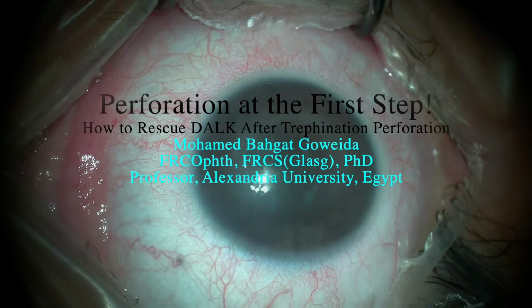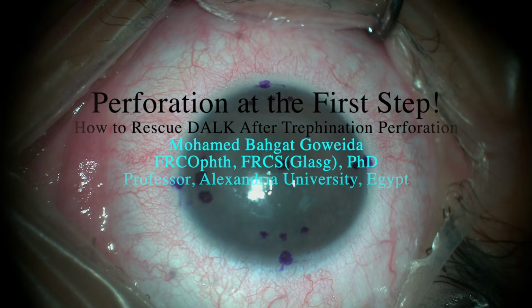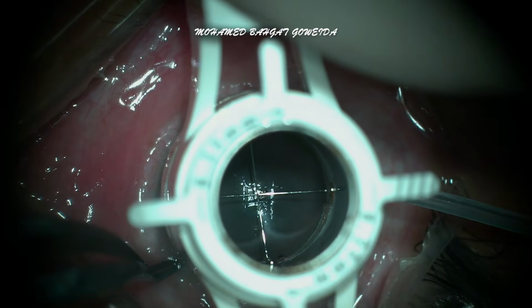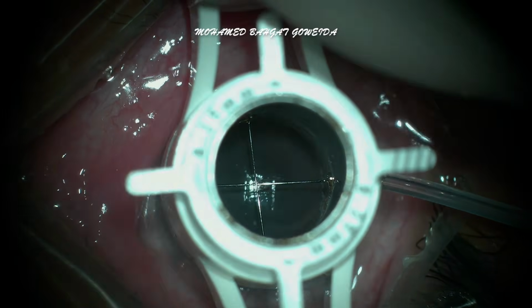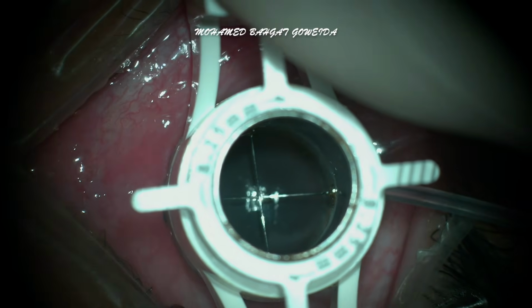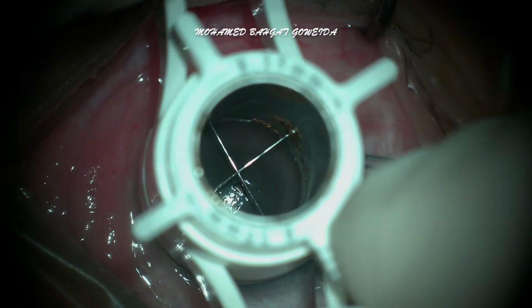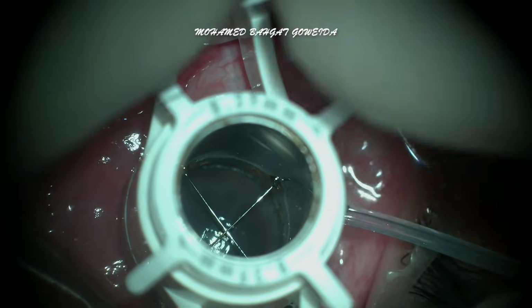Hello everybody, this is a case of DALK for macular corneal dystrophy. In this video I will demonstrate how DALK can still be successfully completed despite an early perforation occurring during the initial trephination. So after the usual marking and centration, partial trephination was started.